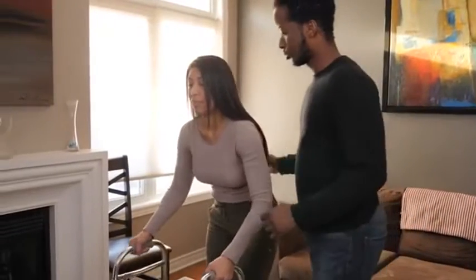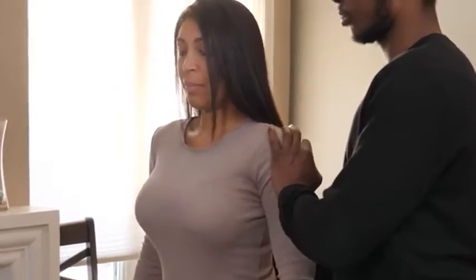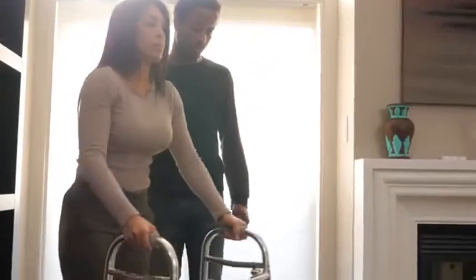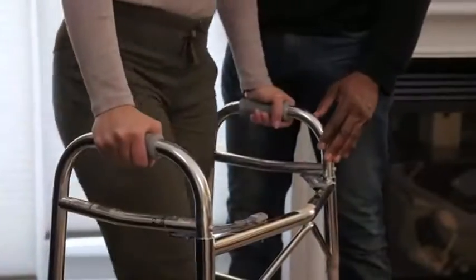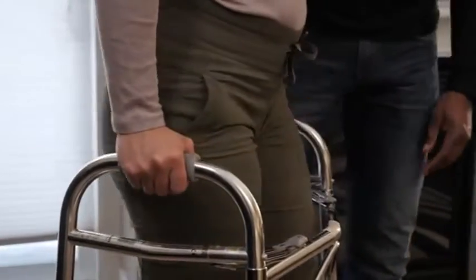Check for this by making sure the person you're caring for is standing upright and they don't have their arms too far out in front of them. If they have to reach out and bend forward to keep a hold of the walker, it's too far away from them. Keeping one hand on the walker and one hand on their back can help them get used to keeping it close by.